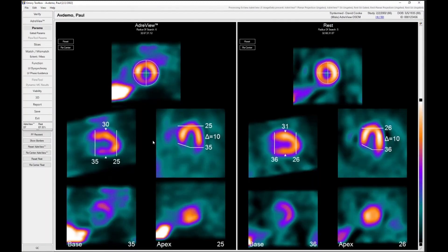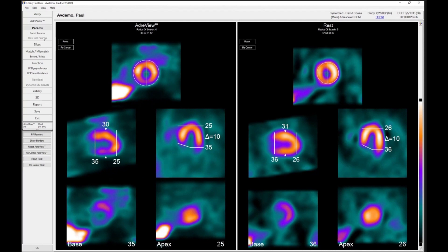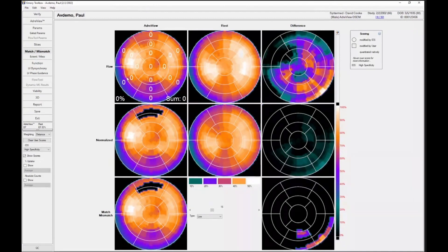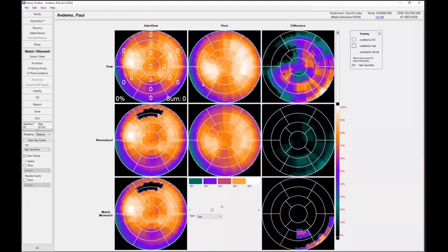The first is the typical method of doing quantification like we do with all of the other tracers, be that SPECT or PET where there is an actual normal file. But in this case, it's kind of flipped from the rest perfusion FDG. So in this case, we quantify the AdReview study, and then the resting study is used much like the FDG to see if there's uptake in the resting perfusion that correlates to a defect in the AdReview.